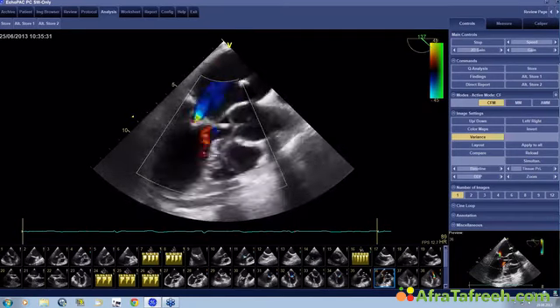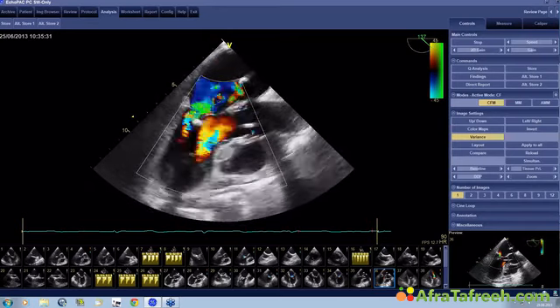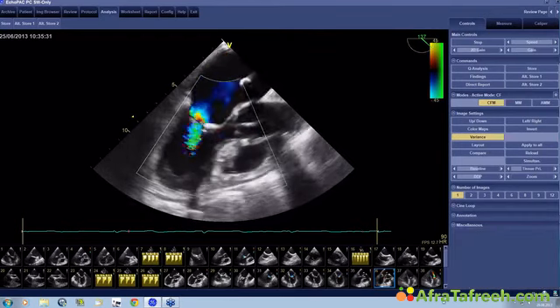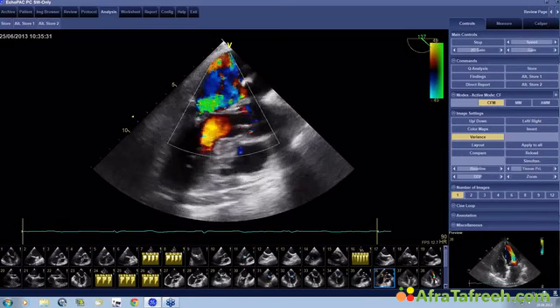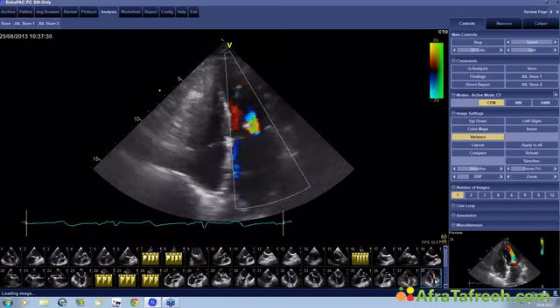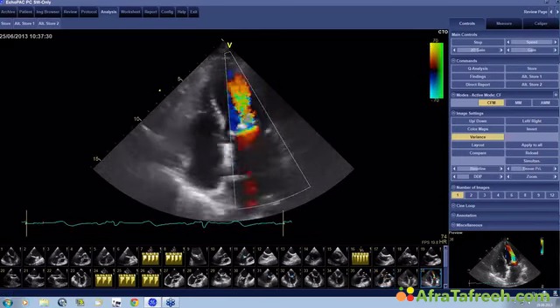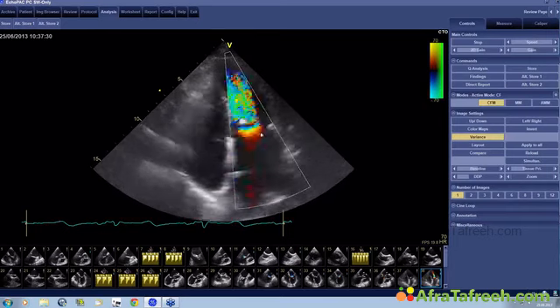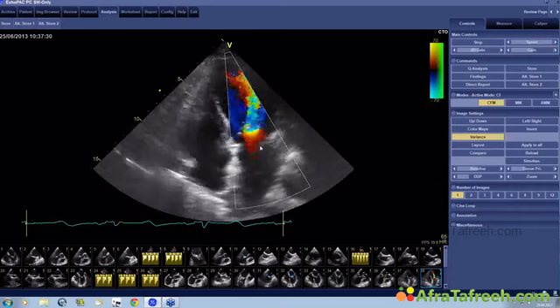I just see that from your comments, many of you also noticed that what you have here is simply very severe mitral regurgitation. So while on the table, I just wanted to take a second look at regurgitation with transesophageal echo, and this is with transthoracic echo, sorry. And this is the jet we have here.